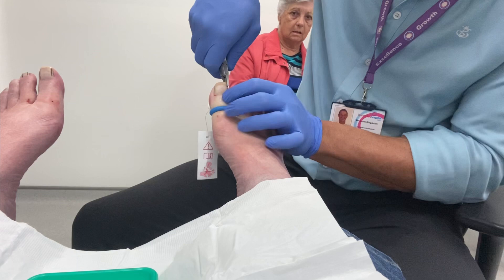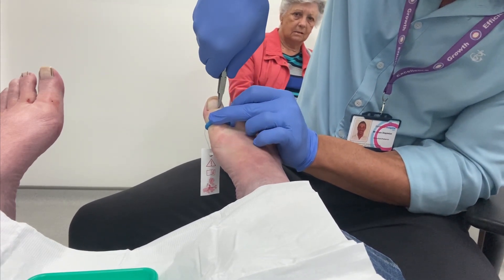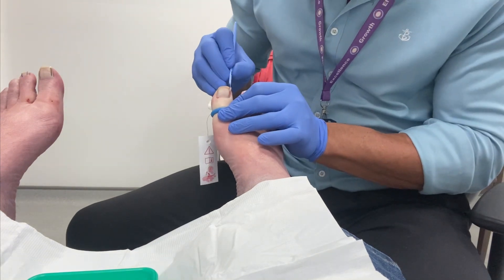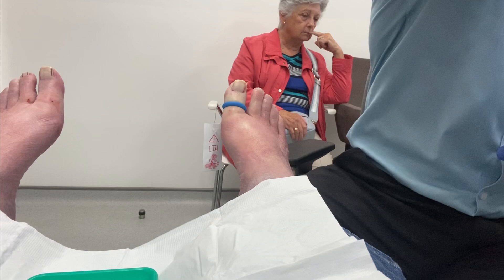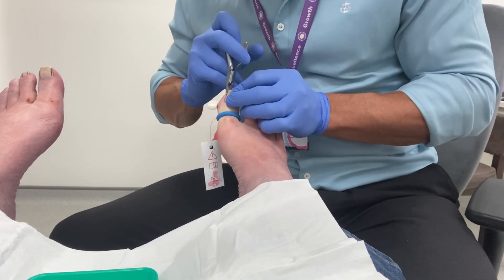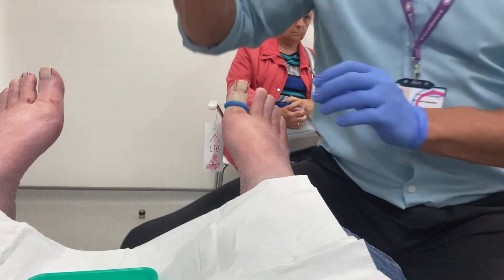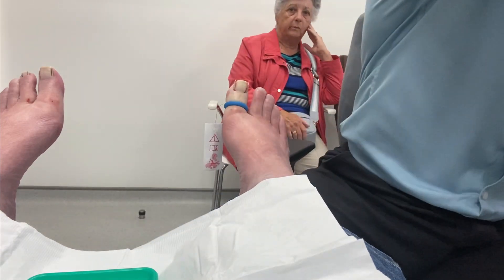His numbing injections had already been completed when I started filming. We are working on his right toe here. First we separate the nail plate to be removed at both lateral and medial edges with our nippers and then with the scalpel. His nail is so curved that I am having to take his nail off in more than one bite with the nippers.